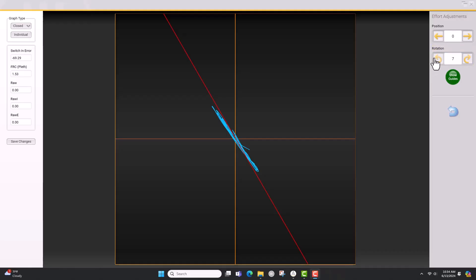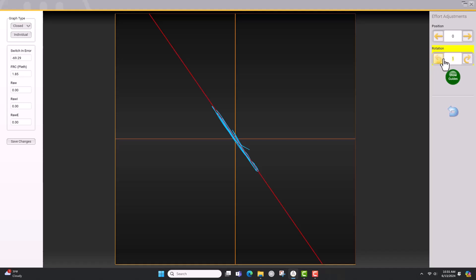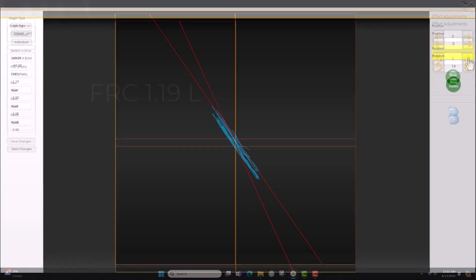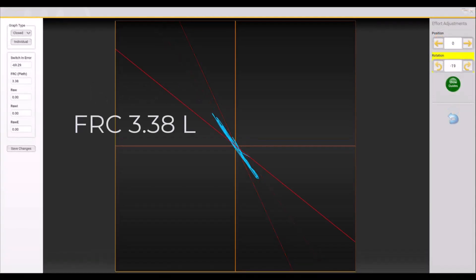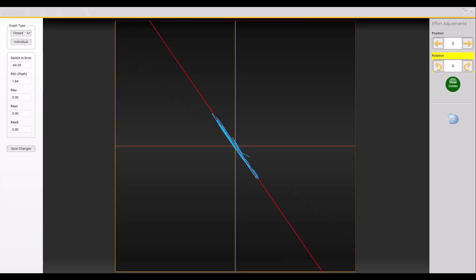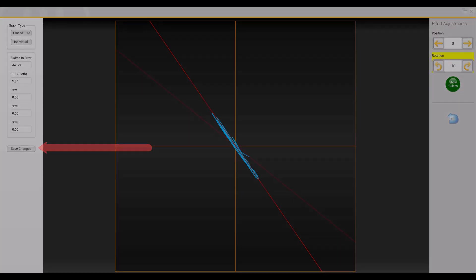As you adjust the line of best fit, the TGV value automatically changes. Note that you should not adjust the line of best fit to get a value — adjust the line to the same angle as the tracing. The more up and down the line, the smaller the value; the more horizontal the line, the larger the value. Once any adjustment has been made, click the Save Changes button to save your changes.